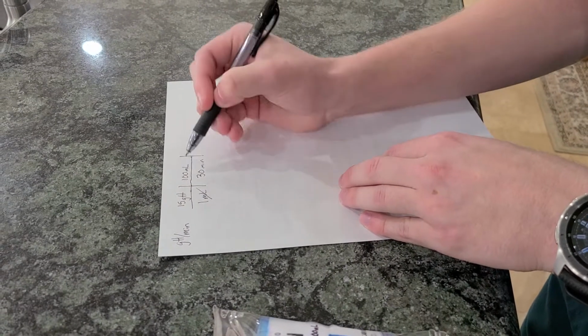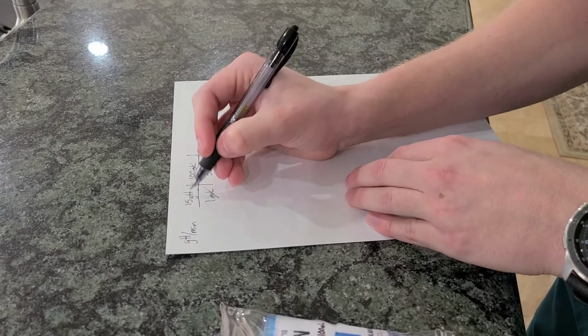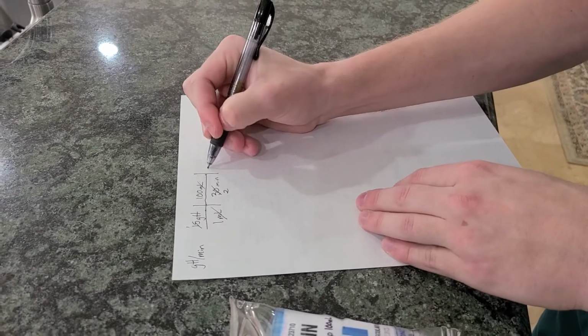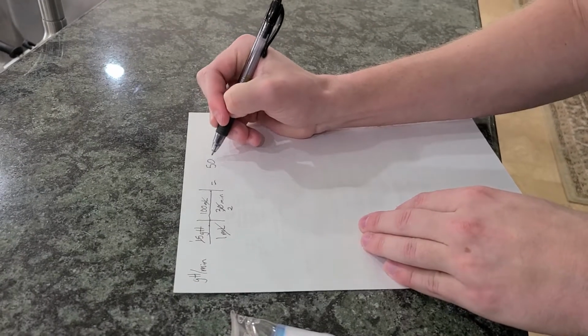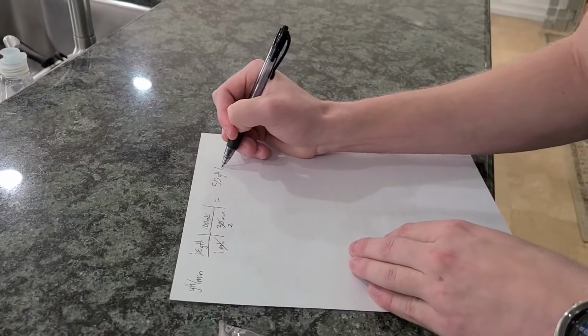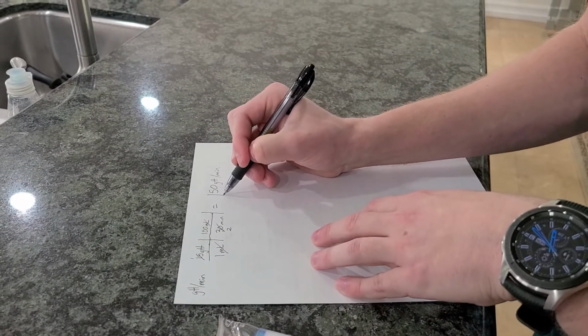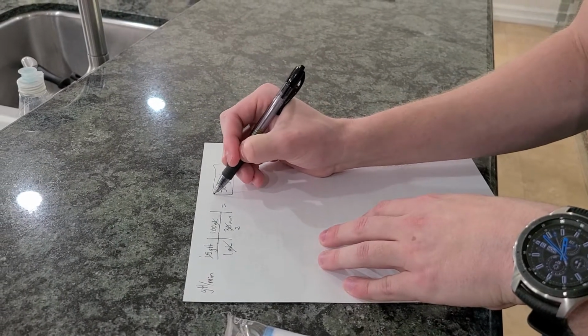The milliliters cancel out, and we get the drops per minute we're looking for. That's going to equal 50 drops per minute, which is about 13 drops per 15 seconds, which is what I'm going to set it to once I hang it.